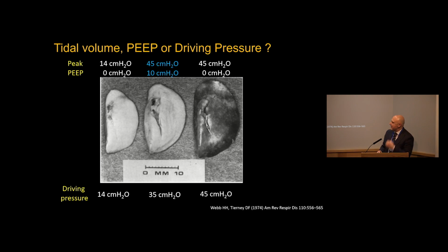So do you remember this study? I've got a couple of slides from Professor Gattinoni, who's been talking about this and developing a lot of the mechanical power issues I will describe in a second. I don't know whether you remember, but this was one of the first studies, a famous study from 1974. I can see some faces. Basically saying that PEEP is protective. Okay, so what does that mean?